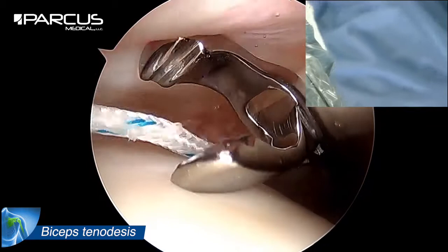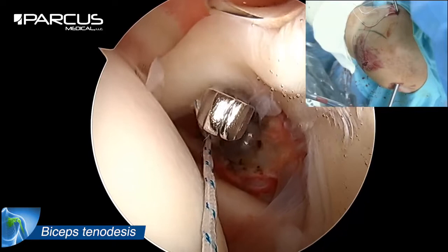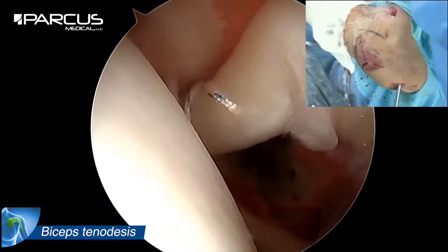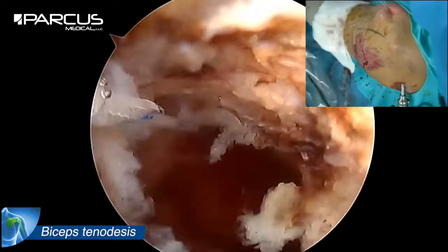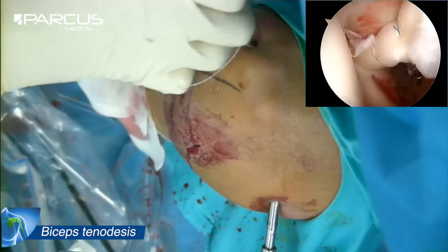We pass the second strand to make a Lasso loop and, if necessary, an additional strand for a double Lasso loop. Successively inverted half hitches allow excellent hold around the long head biceps.